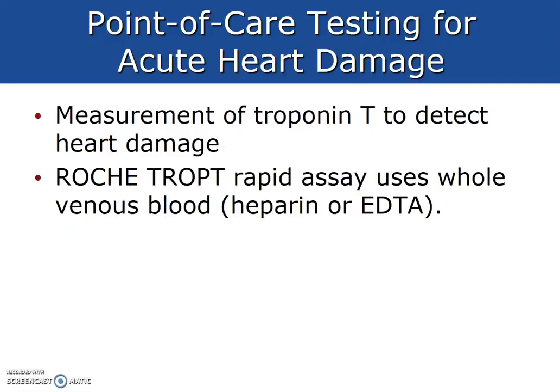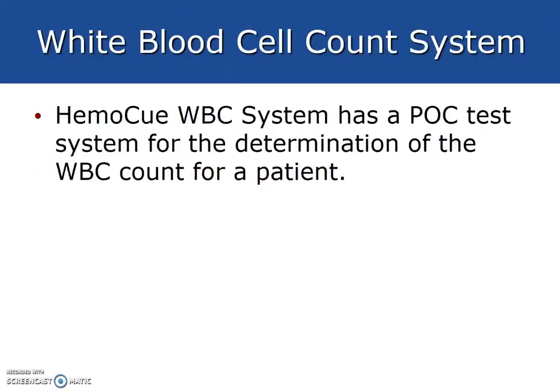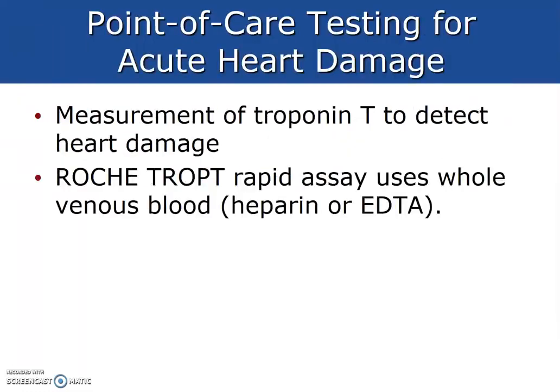Measurements of troponin T to detect heart damage. Roche troponin T rapid analysis uses whole venous blood, heparin or EDTA. I will show you an image of this device in class.